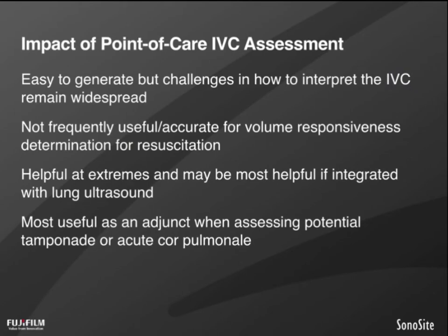So, in summary with the IVC, as I mentioned, it's easy to generate, but there are many challenges in how we interpret the IVC, and that is very common. I hope you, listening, will commit yourself to understanding these challenges and will educate others in how to be a good steward of IVC ultrasound. It is not frequently useful or accurate for volume responsiveness determination in the resuscitative scenarios, except at the extremes.